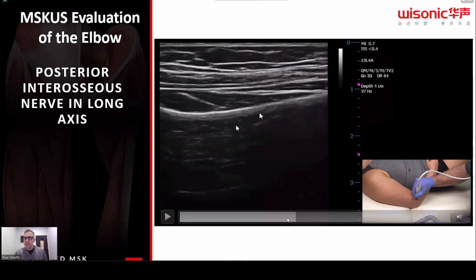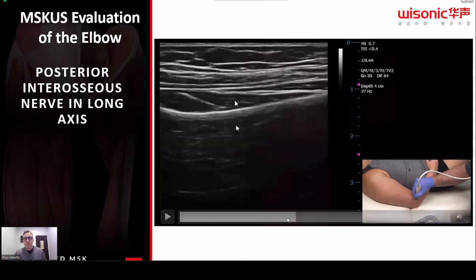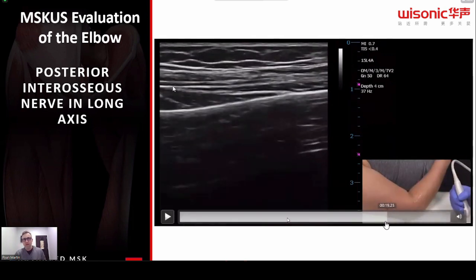Upon inspection of pronation and supination, either actively or passively or with resisted supination, you can possibly see some constricted motion or some squeezing down and causing some entrapment into that nerve right into here. As you can see, there's those two layers right in there.